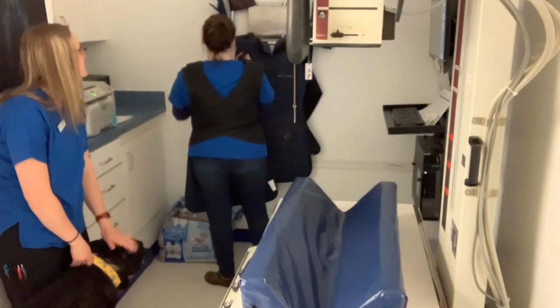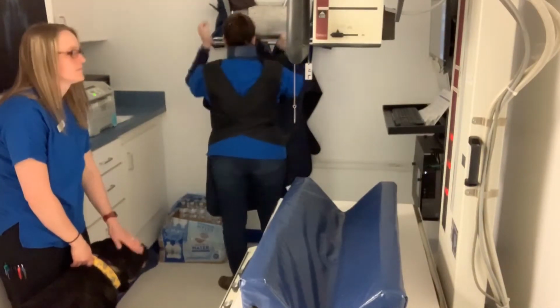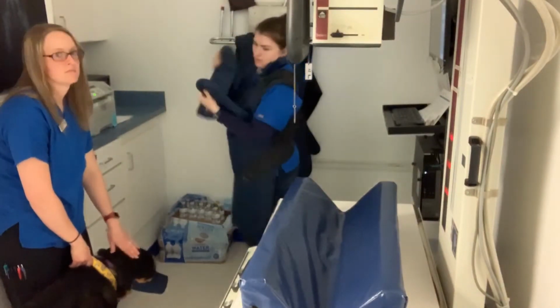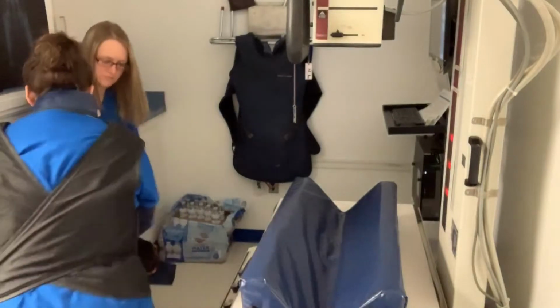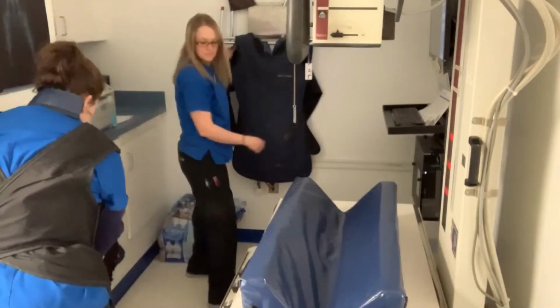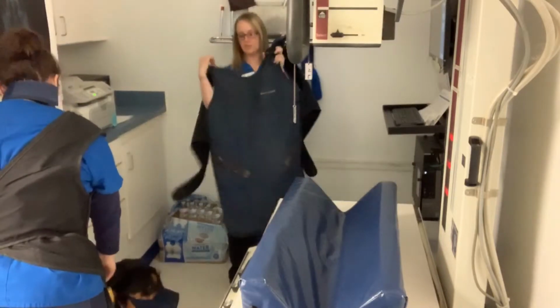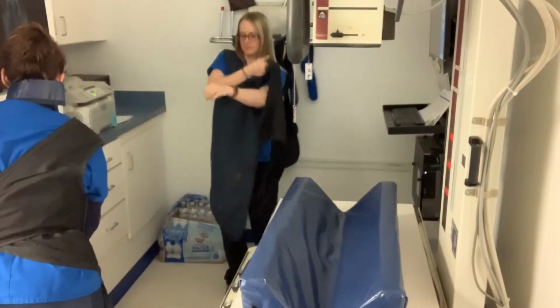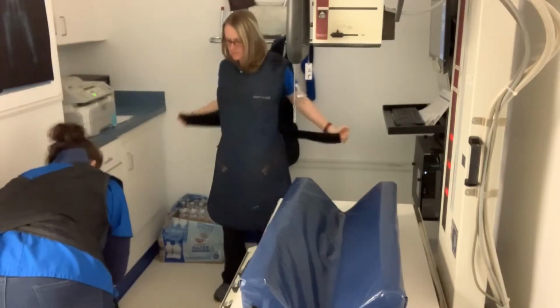Indications to look for in a GI series are recurring vomiting, diarrhea, hematemesis, anorexia, mass lesions, wall distortions or lesions, melena, abdominal organ displacement, chronic weight loss, persistent abdominal pain, foreign bodies or obstruction, and inconclusive results of a survey radiograph.